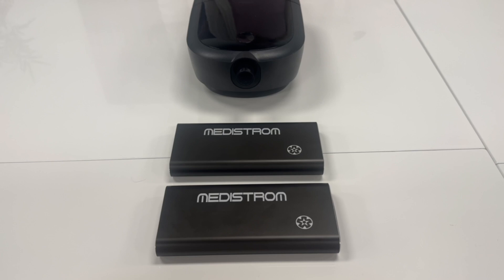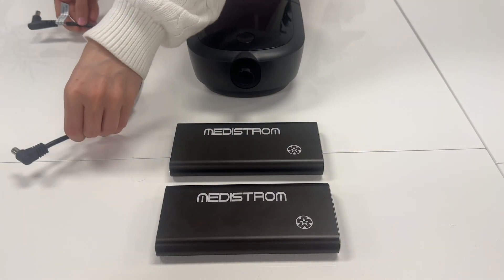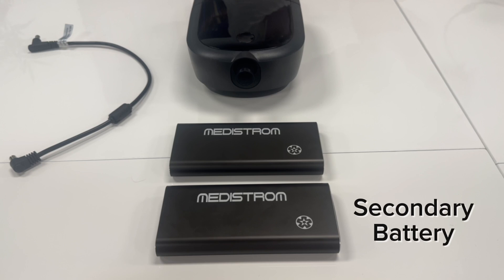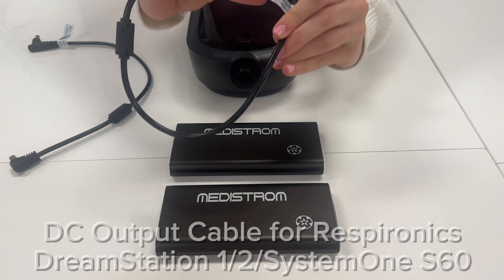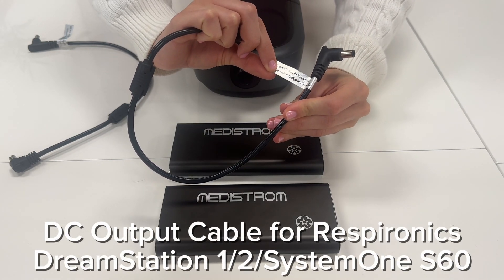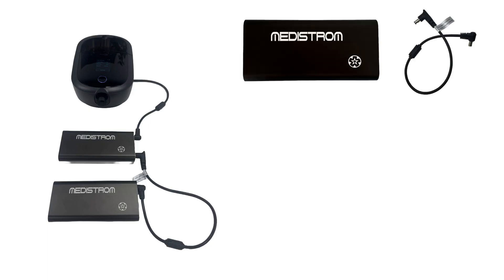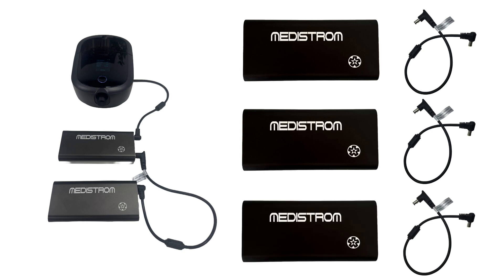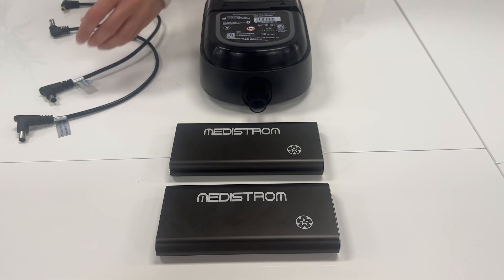To begin, you will need the DC output cable that connects your primary PilotFlex battery to your CPAP machine. In this instance, we will be using the Respironics DreamStation 2 machine, so we will need the DC output cable for Respironics DreamStation 1, 2, and System 1 S60. You will also require a cable to connect your secondary PilotFlex battery to the primary PilotFlex battery. When using a 12-volt machine, you must use the DC output cable for Respironics DreamStation 1, 2, and System 1 S60 to connect the batteries. Please note that you will require additional DreamStation DC output cables if you wish to connect more batteries in series. These cables are not included with the PilotFlex battery and are available for individual purchase.